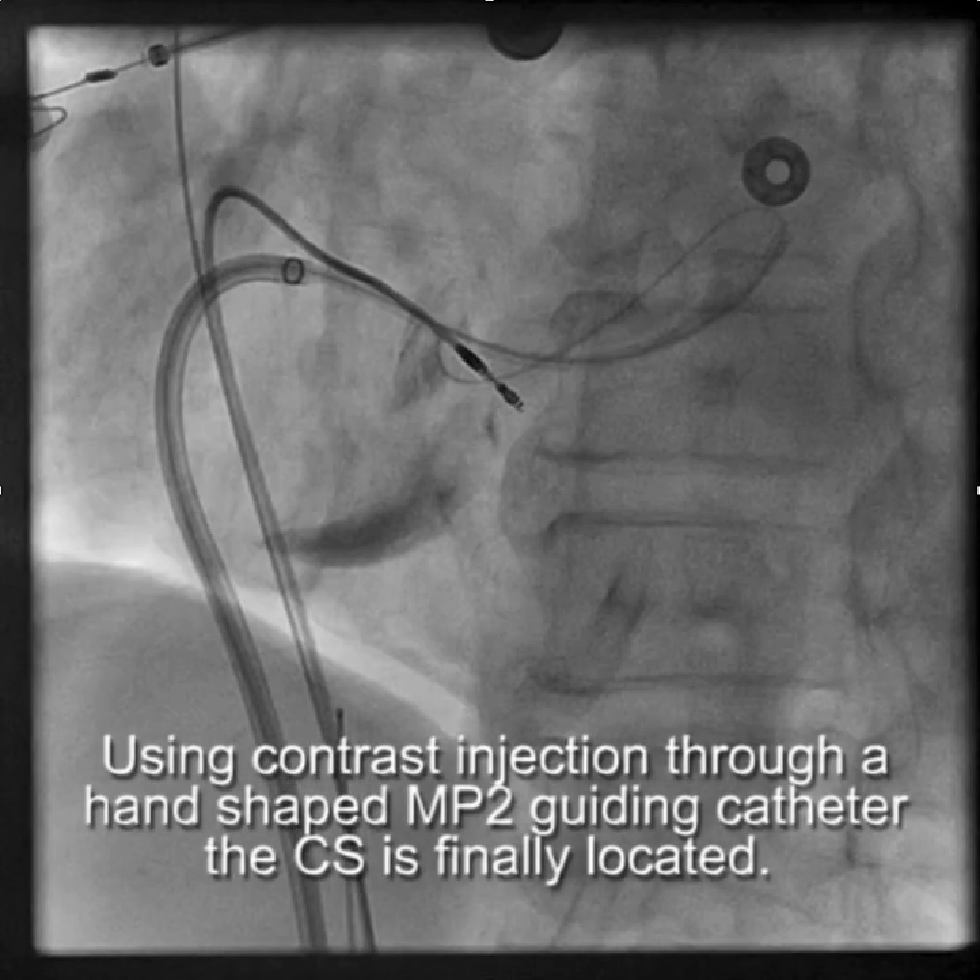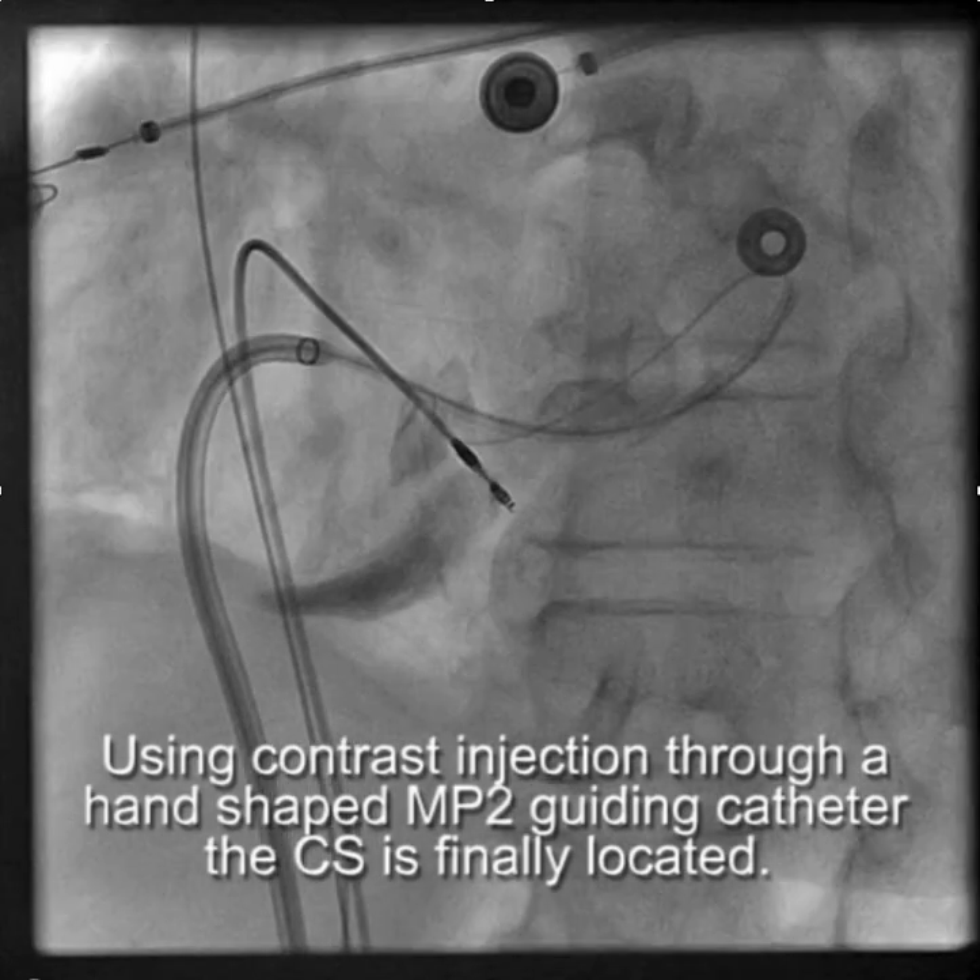It turned out that this patient had a double-chamber right ventricle. So in addition to her other venous anomalies, she had that, which made finding the CS quite difficult. It was very much higher than you would expect — way up by the HIS location. We were able to locate the CS.